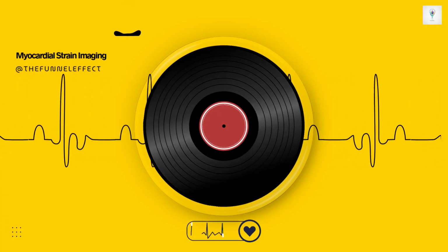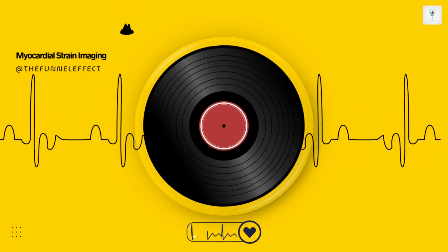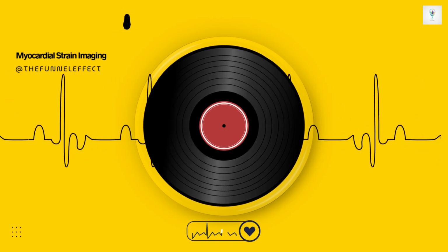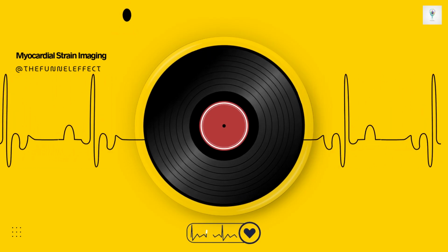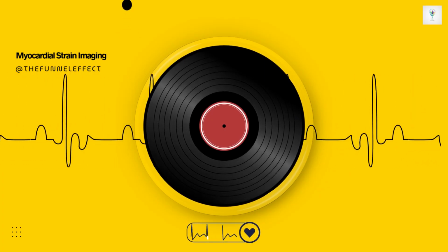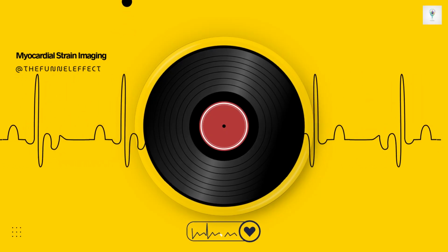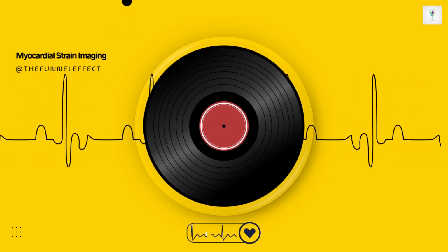So, like in a scarred area, the healthy parts contract and stretch the scar tissue. That stretching consumes energy but doesn't help pump blood. Precisely. That's a classic example of wasted work. And from these, we can calculate myocardial work efficiency, which is simply the ratio of constructive work divided by the sum of constructive and wasted work, usually given as a percentage.